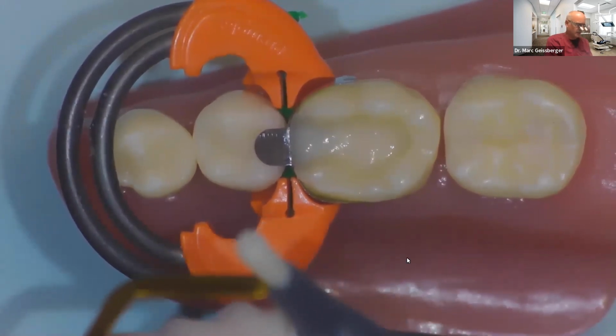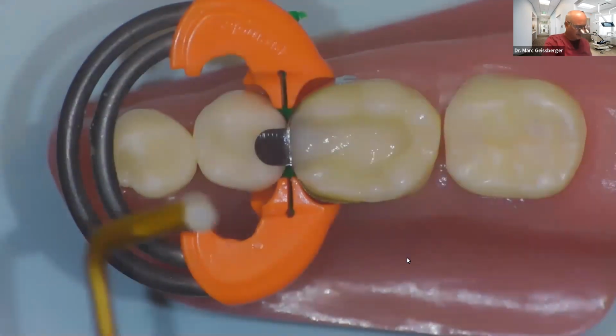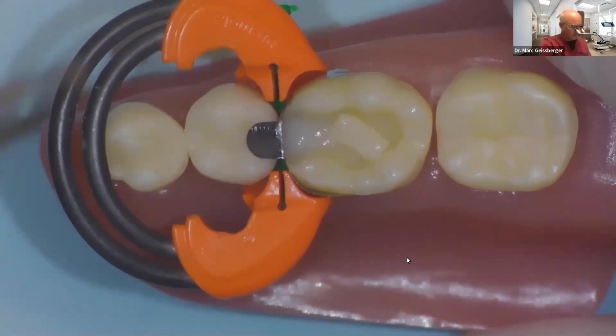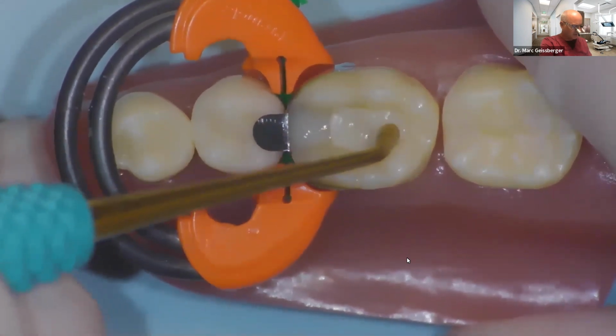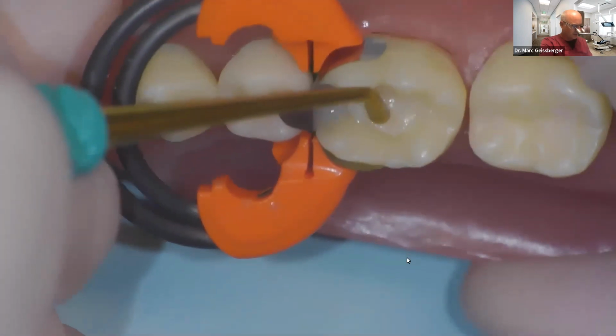Now this would have already been done. I cut off what I want, and I'm going to layer the next layer right along the occlusal portion of the tooth. Now, you're probably asking yourself, why didn't I go right back into the box form? And that's a very valid question. And there's, I think, what I consider a very valid reason for not doing that.